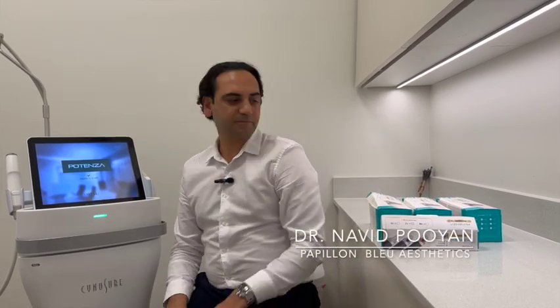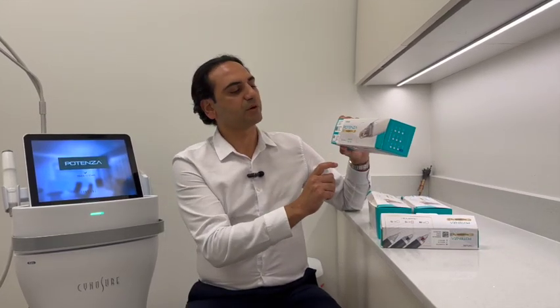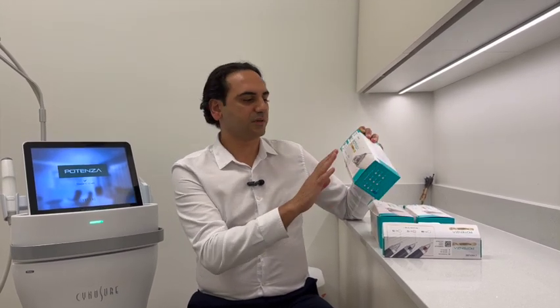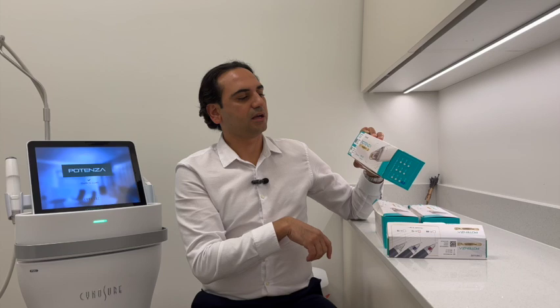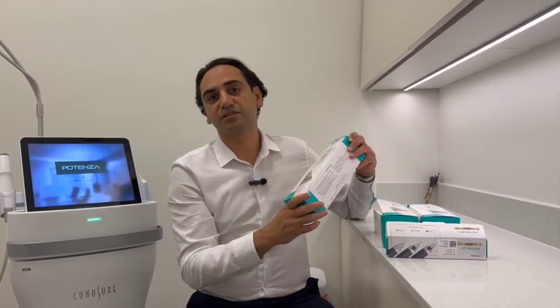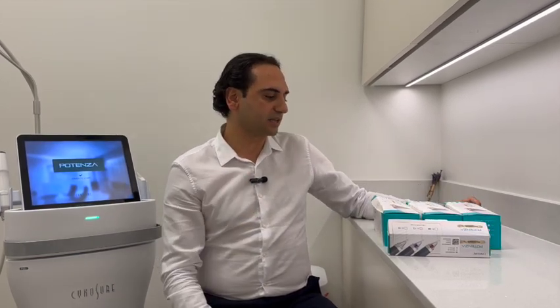Hello, this is Dr. Pooyan from Papillon Bleu Aesthetics. Today, I'm going to talk about different types of tips of the Potenza RF Microneedling system. It is one of the most common questions we get from colleagues who are new to this system, from our trainees, and also some patients who want to dive into more details about this amazing device.